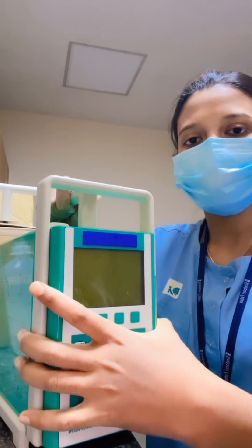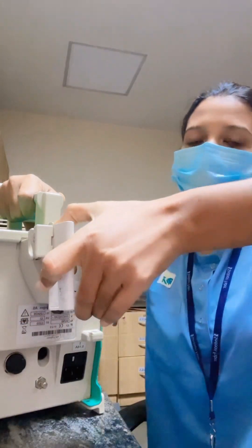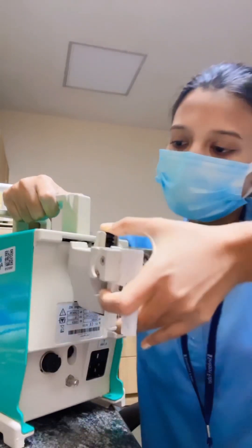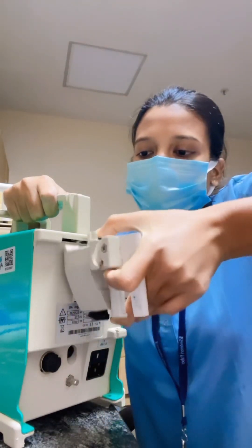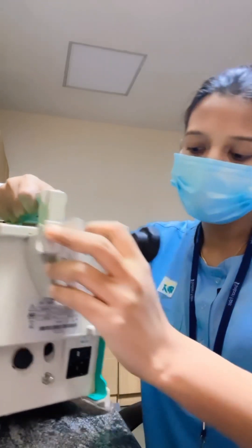The various components include, first of all, the clamp. This is how you detach it. For fixing it back, just press this black button, then fix it back. You can shake it to check if it's fixed properly or not.